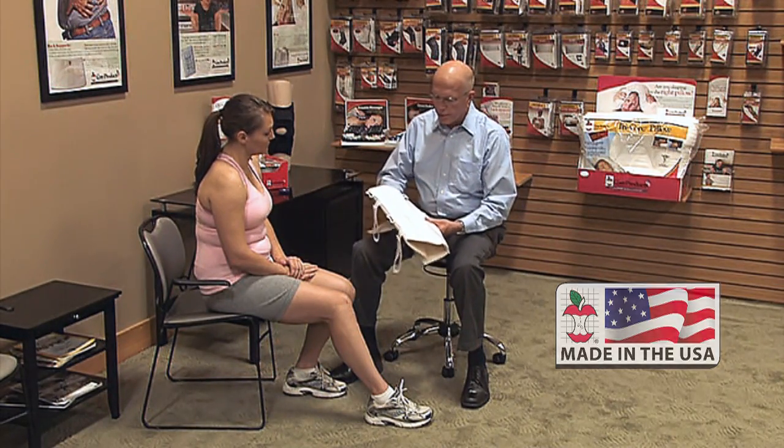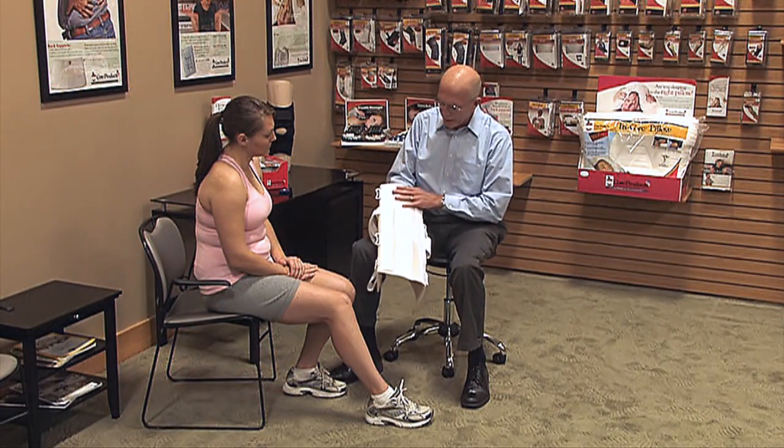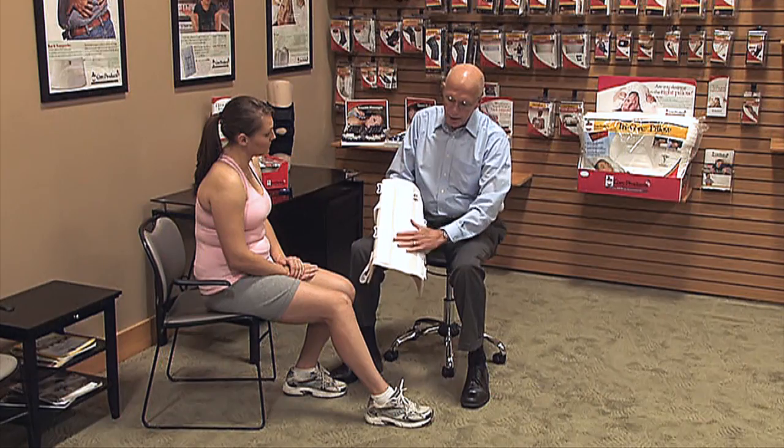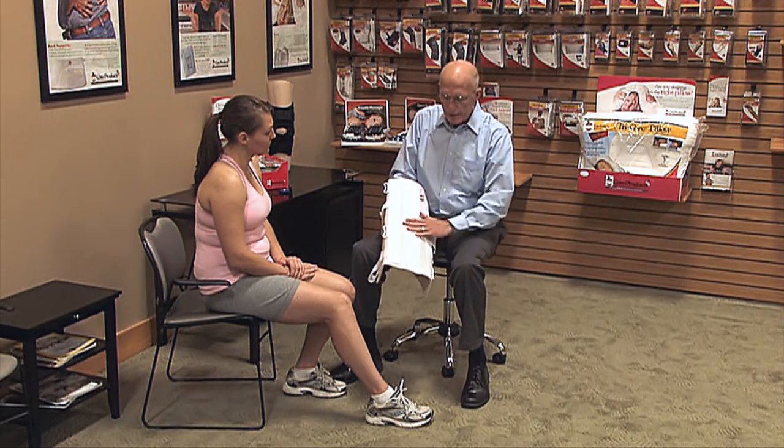The universal knee immobilizer has pre-shaped steels in the posterior. It's contoured to the popliteal area and then contoured around the calf for patient comfort, and with that contouring we get maximum motion control.